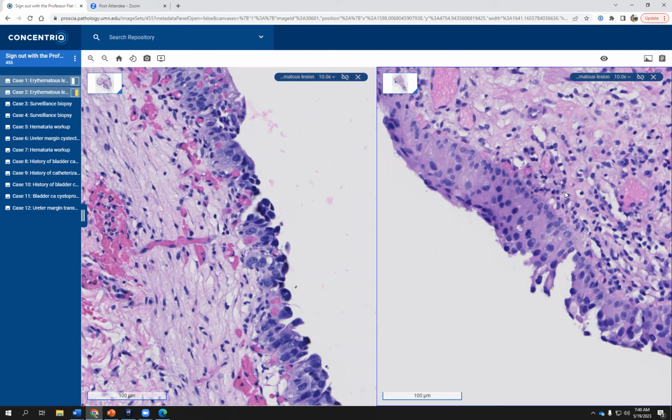Many carcinoma in situ acquire this bright pink characteristic in their cytoplasm. And oftentimes when this happens, if the cell borders are well defined, you can also see the nucleus pushed to the periphery of the cell, somewhat an eccentrically placed nucleus in a cell that is brightly eosinophilic, which should make you think of the possibility of carcinoma in situ.